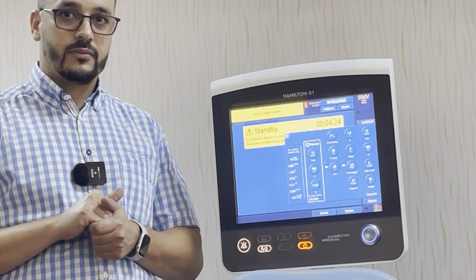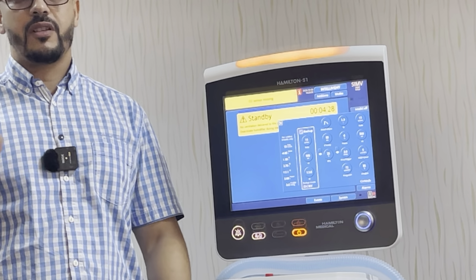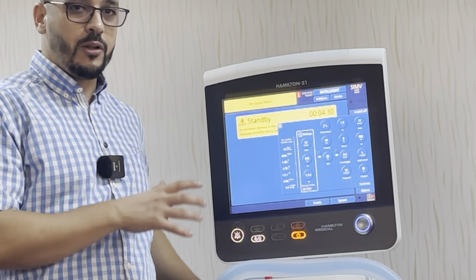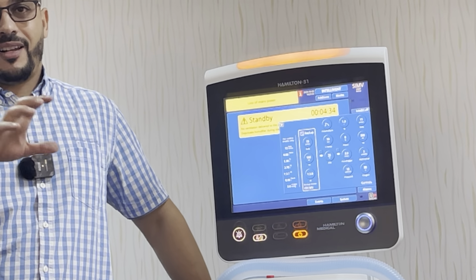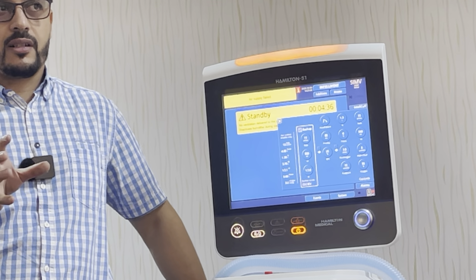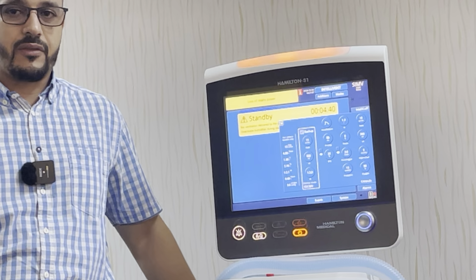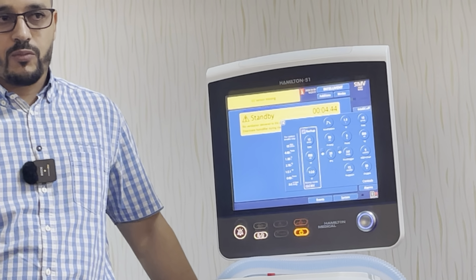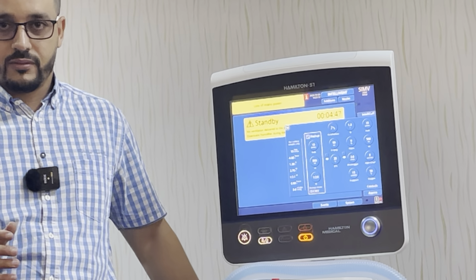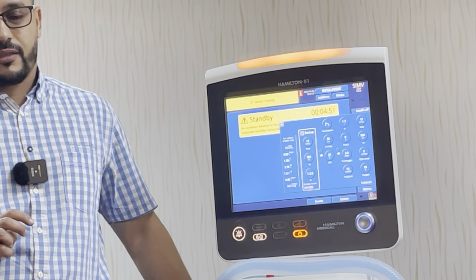هذه في الهاملتون بس ولا في اس اي ام في؟ هي المفروض في الاس اي ام في كله بصفه عامه، لكن انا توا بحكم نعرف الهاملتون احكي لكم على الهاملتون. ممكن الاجهزه الثانيه هما المودز الستاندرد مش مر عليها السي ام في. في الاجهزه الثانيه حتلقوه اسمه اي سي اسيستد كنترول. اي سي هو بنفسه سي ام في هي قصدي لا فكره في الاس سانكرونايزد.